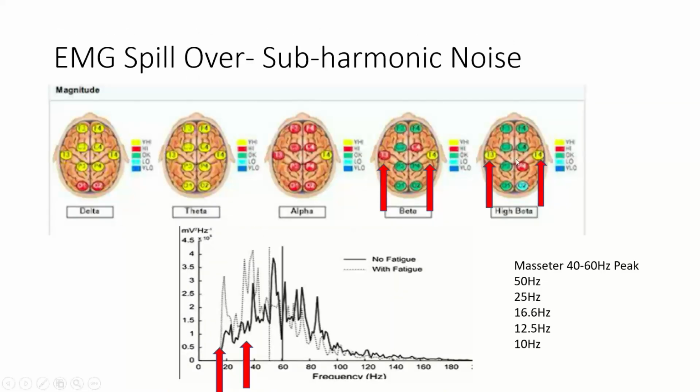Now, on your brain map, you might see T3, T4, and high beta, especially if it's localized. Odds are, 90 to 1, it's EMG, even more than that, actually. This is probably masseter with a 40 to 60 hertz peak. So it'd be somewhere in the range of these two lines right here. And then as we go over to beta, we notice that same area is elevated. Maybe not in T3, that could be fatiguing over there, or maybe not as much firing.